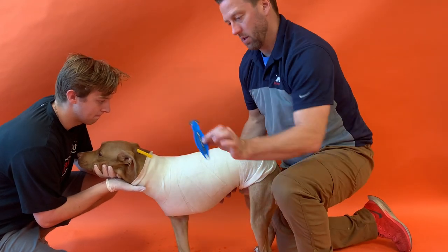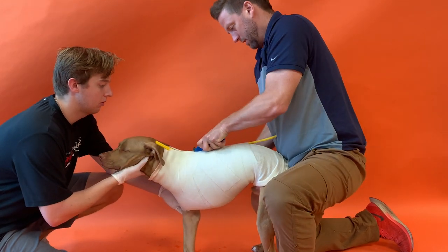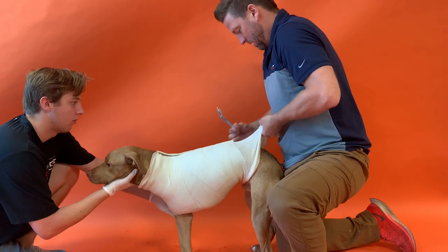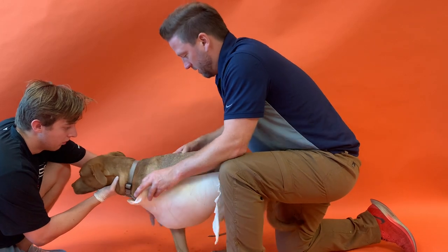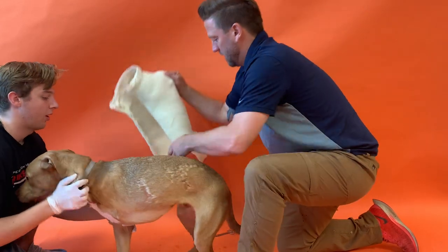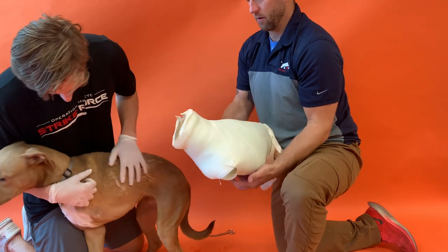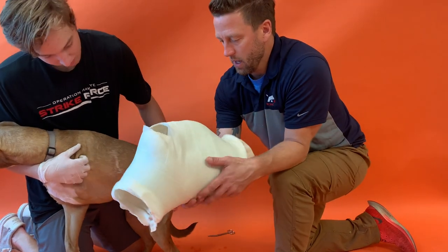Take the clever cutter and go right down the spine over the cut strip to remove it. Then cut down the middle of the stockinette, bring it straight down carefully, and lift the dog right out. You'll have a nice molded body shell with a hole for the good leg. Let it sit for about three more minutes to completely cure — that's what we want for full limb prosthetic casting.